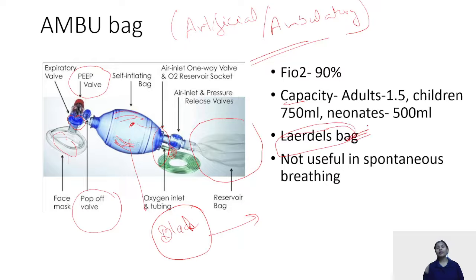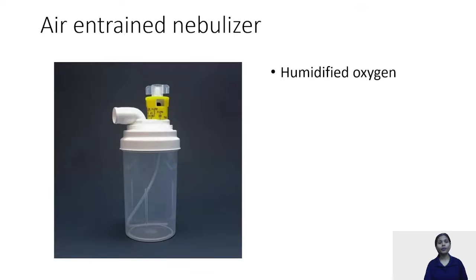The major disadvantage of this AMBU bag is you cannot use it for spontaneous breathing, because it provides very high resistance, and the patient cannot overcome that resistance. A spontaneously breathing patient should never be put on an AMBU bag. I hope I'm very clear about it.